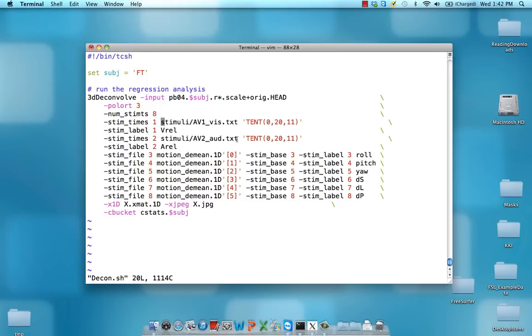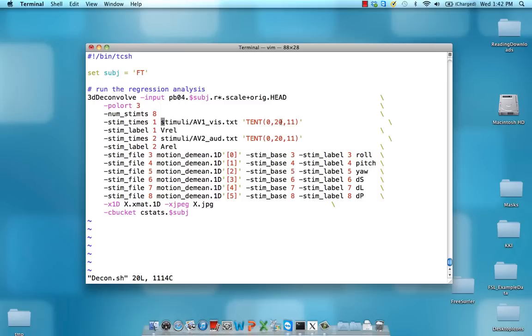At every time point in these files it says we're giving a visual stimulus or an auditory stimulus, and now within this window from 0 to 20 seconds afterwards, estimate 11 time points. I've made much of the rest the same.